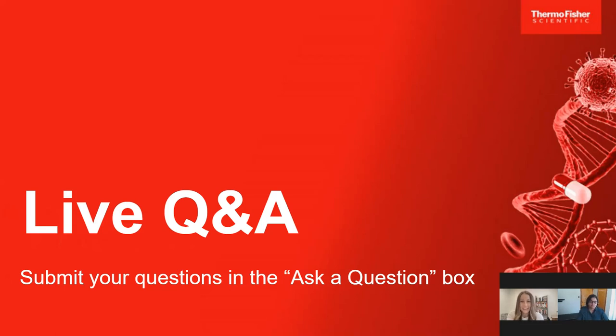Thank you. Another question here: what are the key differences in completing immunofluorescence staining in a well plate and on a slide? The key difference if you are doing it on a plate or on a tissue is that there will be a difference in the antigen retrieval and permeabilization buffer. Because if you are working on cells, you don't want to do very harsh antigen retrieval or permeabilization. The concentration of permeabilization buffer, Tween 20 and Triton X, will be much lower with cells as compared to tissues. So that's the major difference.